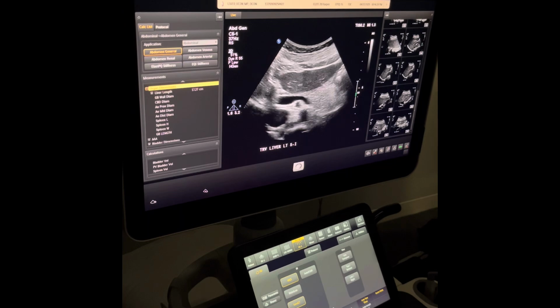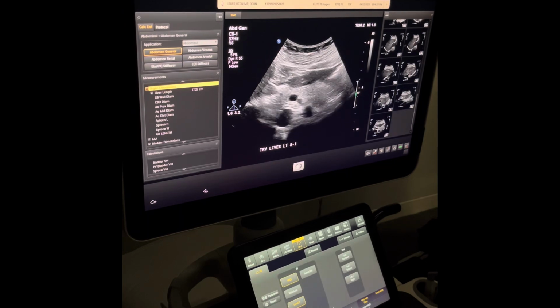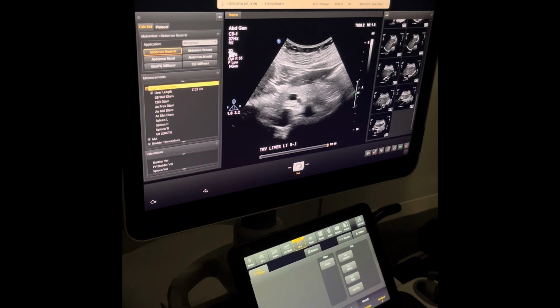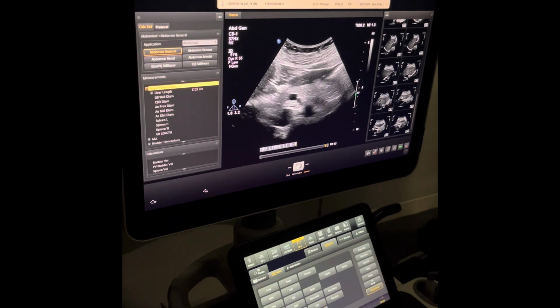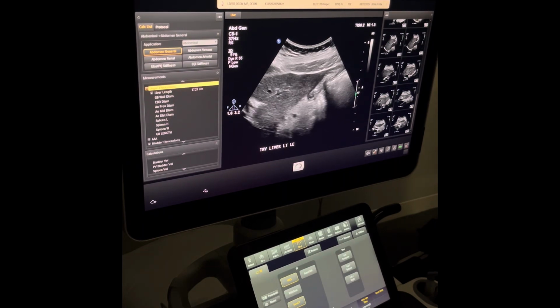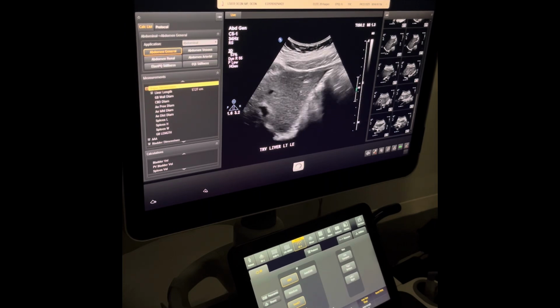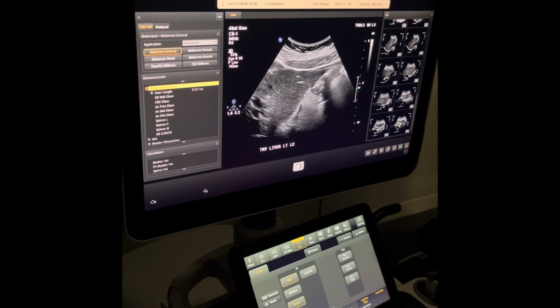You can see the pancreas start to come in here. And I think that last one could be my last image, but I'm just going to take this one as well to prove we're completely out of it. And now I'm going to be looking at the lateral edge here. Pretty much same concept as the tip. Just want to make sure there's nothing hanging off the edge. And take a small breath in, hold.